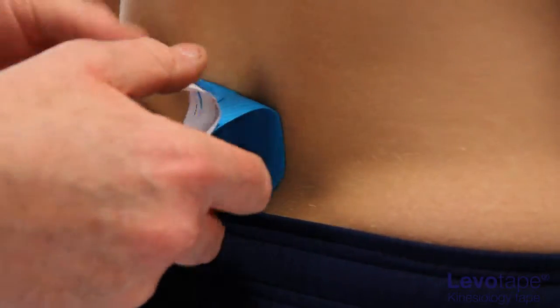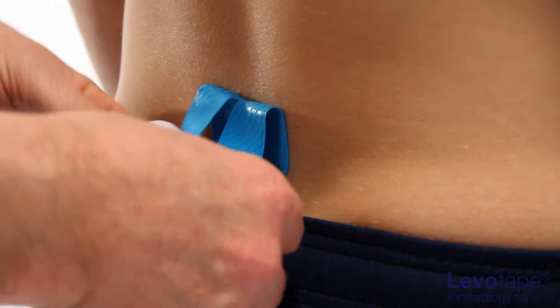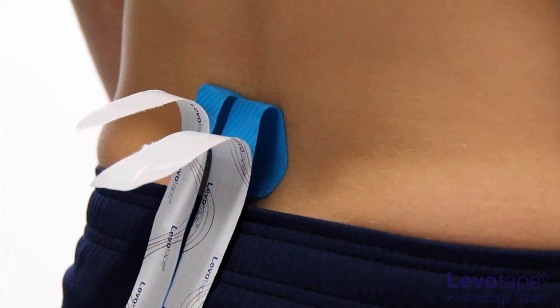With the patient in neutral, lay the base point between the two PSISs as an anchor without any stretch.